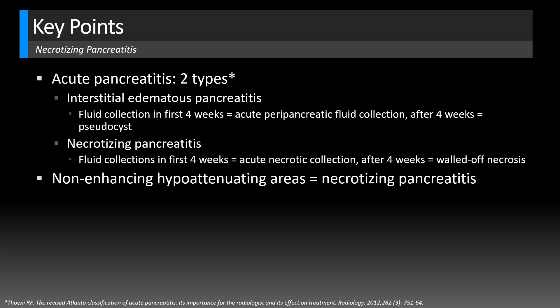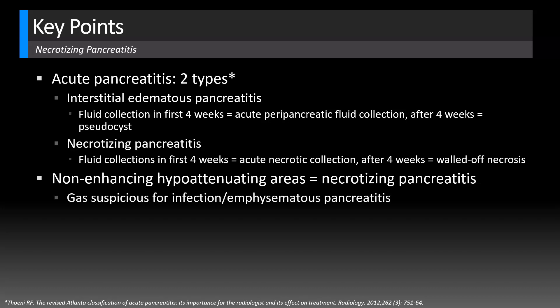Necrotizing pancreatitis is identified by areas of non-enhancing hypoattenuation. You also want to look for any gas, which raises suspicion for infection or emphysematous pancreatitis. The term pancreatic abscess is now discouraged — it's better to specifically say infected pseudocyst or infected walled-off necrosis. Necrotizing pancreatitis is more likely to be complicated by superinfection. There are two types: parenchymal, involving just the pancreas, and peripancreatic, extending into the mesenteric and omental fat — you can also have both, as in this case.